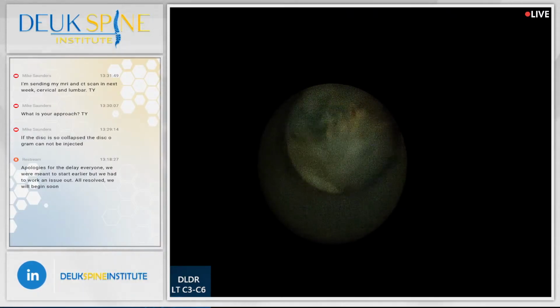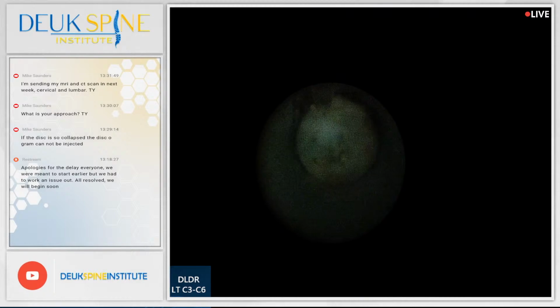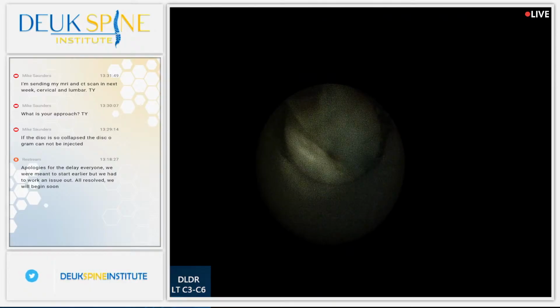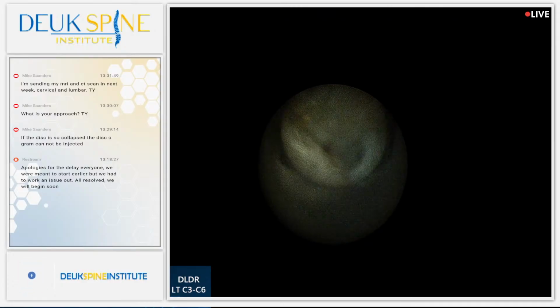That makes it more difficult because there's all that scar tissue stuck in behind the esophagus right up against the metal plate. That makes it a lot more difficult to get access to the disc from the front. But we've already achieved the access we needed, so we're actually doing pretty good.